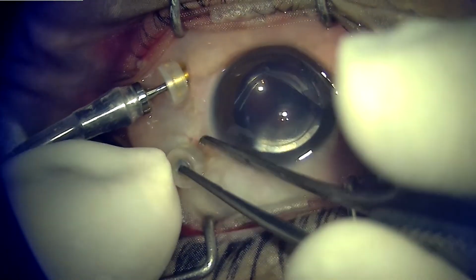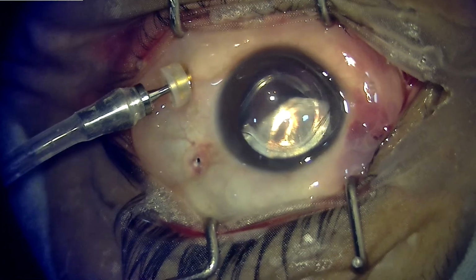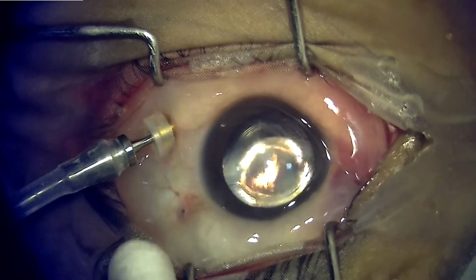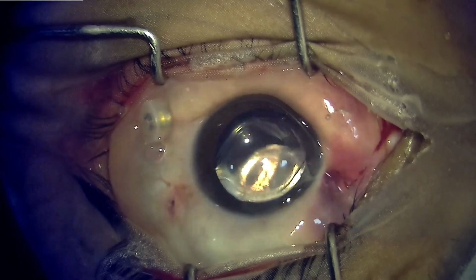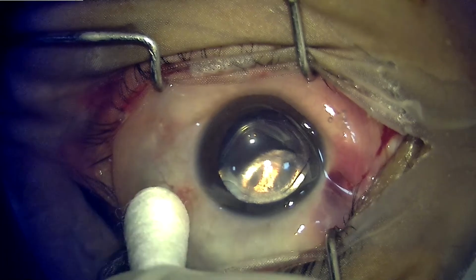and then the time comes to change the fluid with the gas. So air has been instilled after removing the fluid from the vitreous cavity and removing the trocar cannula from the sclerostomies, and these are self-sealing sclerostomies, so there's no need to suture them. They will simply seal on their own, provided some amount of massage and manipulation is done on the surface.